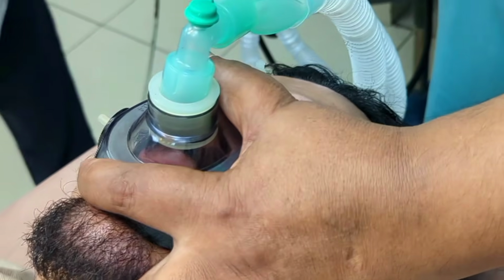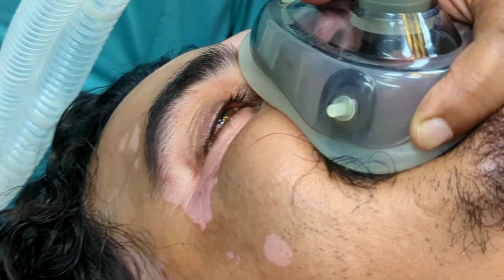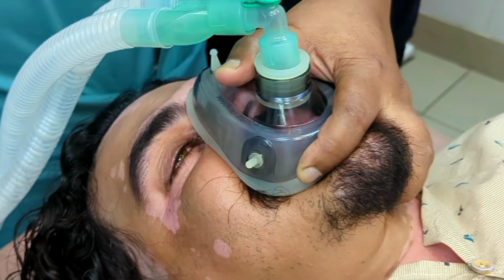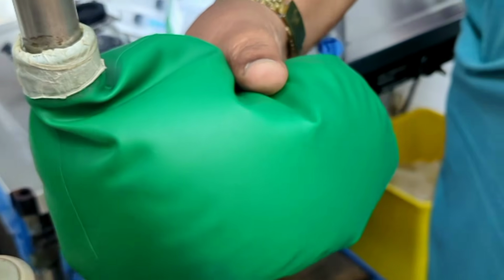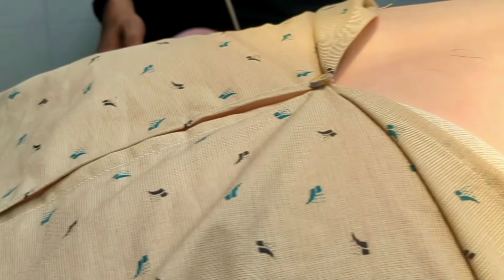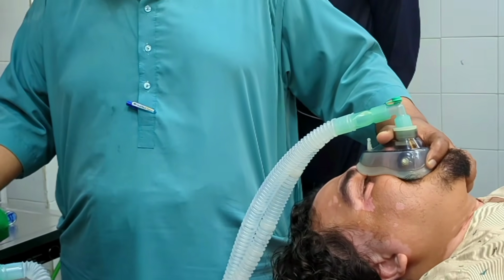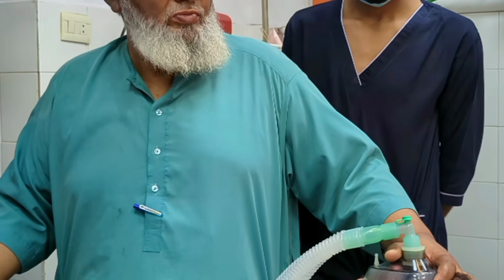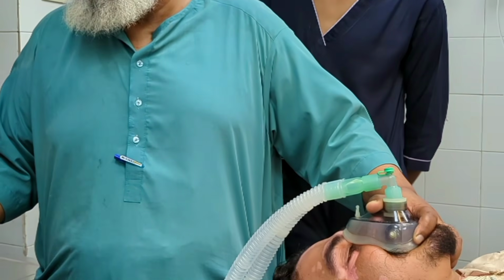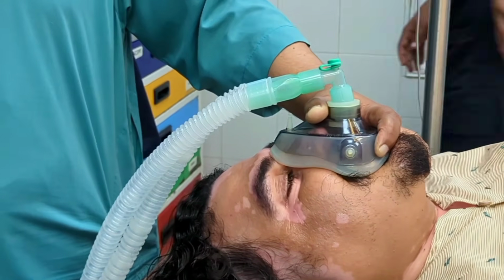At this stage, it is extremely important to pre-oxygenate the patient before attempting intubation. Pre-oxygenation is done to build up a reserve of oxygen in the lungs and bloodstream, because during intubation there may be a short period where the patient is not breathing adequately. By providing oxygen in advance, we can safely bridge this interval. For pre-oxygenation, a face mask was placed firmly over the patient's nose and mouth, and oxygen was delivered for approximately 3 to 5 minutes. This ensures that the patient's oxygen saturation is maximized before proceeding to the next critical step.